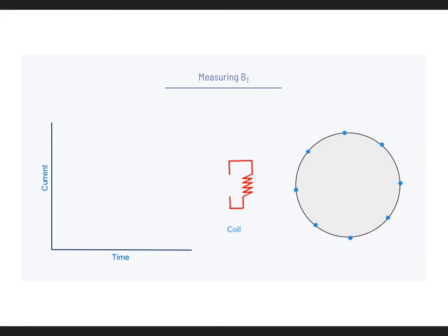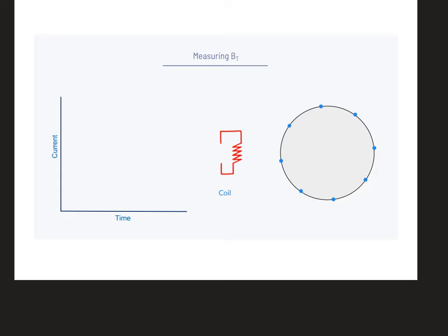So if we pause this circle, here it's paused, it's no longer spinning, we can see this proton right here lies opposite to this one right here, so they cancel out. The left and right components cancel out. So here and here, these also cancel out. This cancels out with that, and this cancels out with that, meaning there is no longer any transverse magnetic field. So what if a radio frequency pulse was added? Like we said, this causes the protons to spin in sync, or in phase. So what would happen is all of these protons would move and start spinning in the same direction.